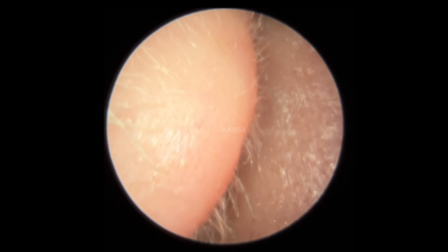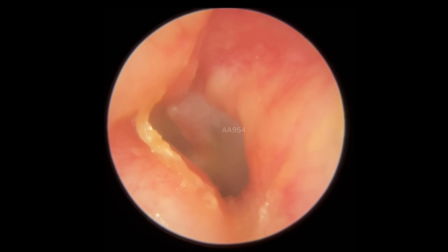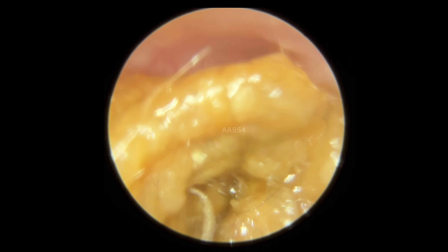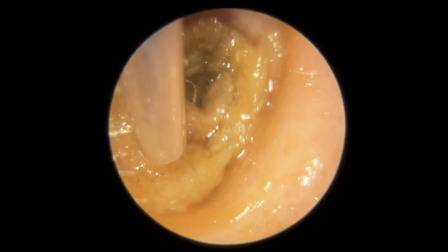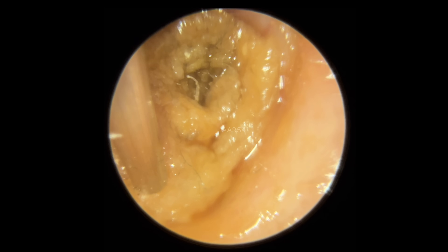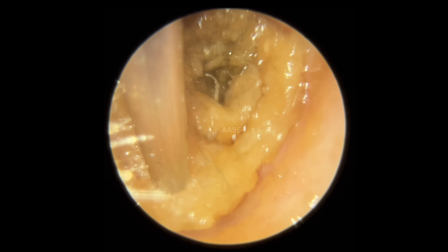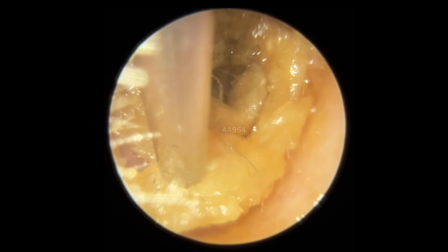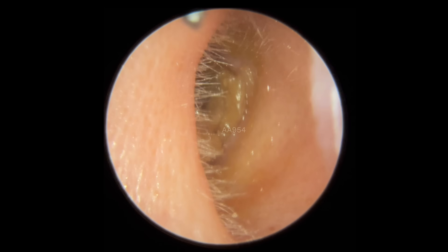That's come out. You can see this really thick plug with that skin around it — but look at those exostoses. I've paused the video so you can see those lumps and bumps all the way around the ear canal. You can see how this would become problematic if those start to touch, or if you get any debris forming on the other side of the exostoses — it's really difficult to get tools beyond them to remove that effectively. You also wouldn't really want to use water in there because you'd get a lot of water trapped behind those exostoses.